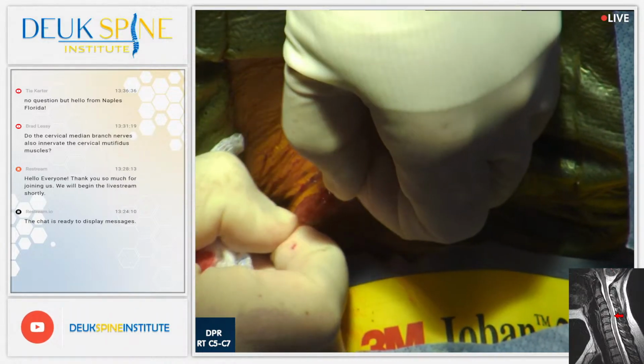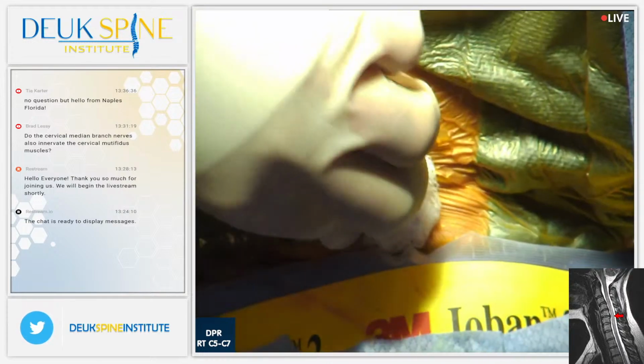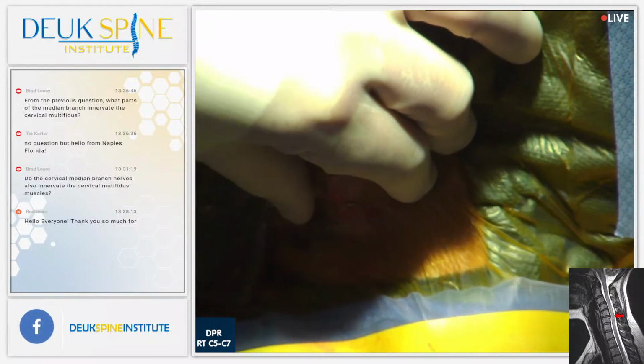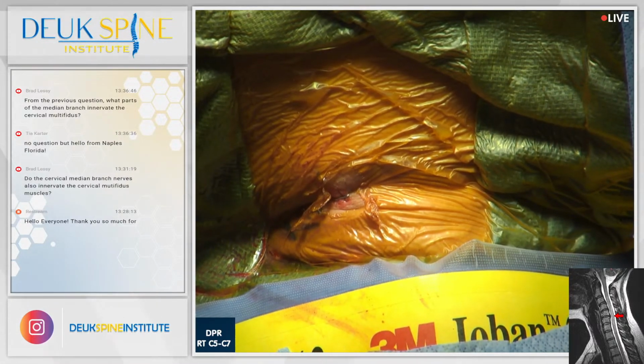All right. Any other questions? If not, we're going to end the live stream. We're going to come back with her anterior cervical. She's getting a disc fixed as well. So we're fixing the facet pain and her disc pain. I'm just putting one little staple there. We'll put a nice sterile bandage and we'll be good to go.